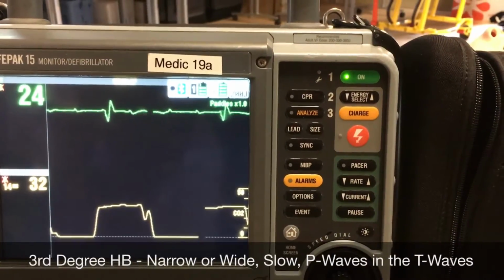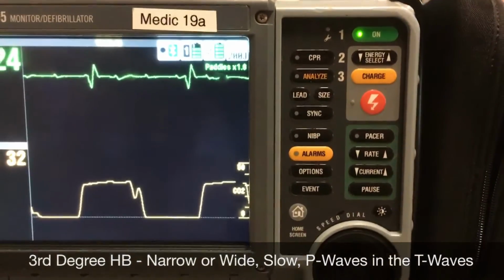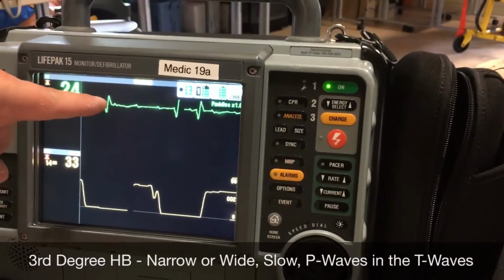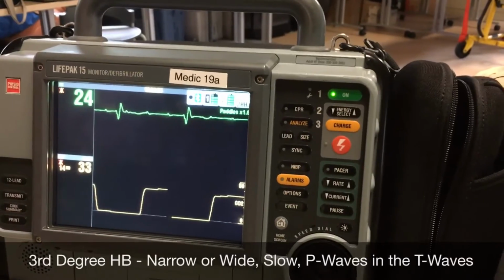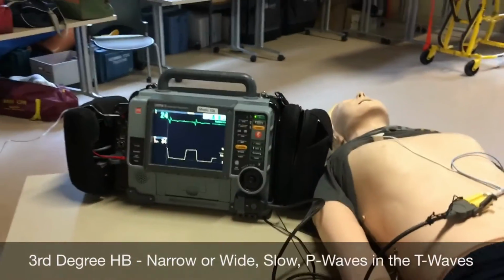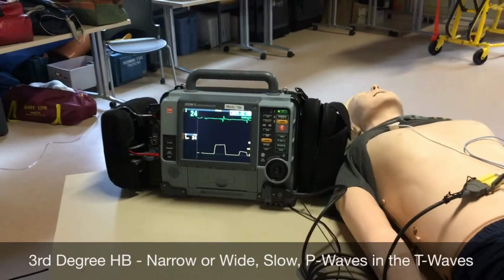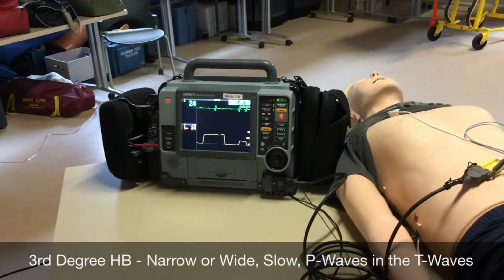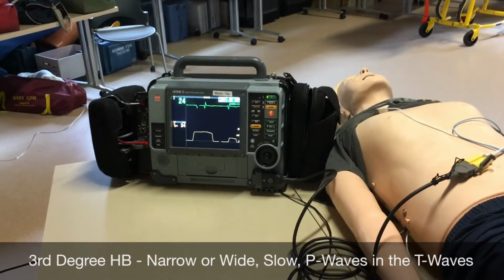So when you see P waves like these here that are right in the area of repolarization, that's not possible in any other rhythm other than third degree heart block. So that's your first cue that it's third degree. So wide, slow, and P waves in the T waves should be the way that you quickly recognize third degree heart block from any other heart block.